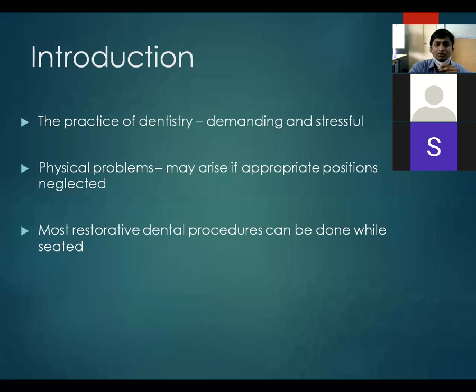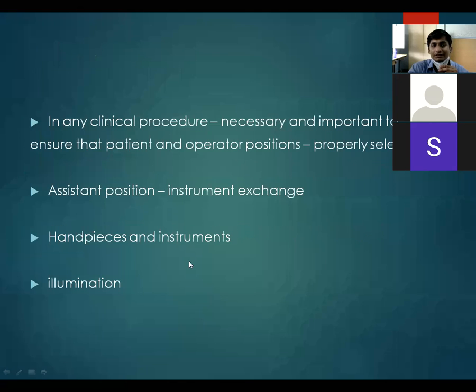Most restorative dental procedures can be done while seated. Compared to the other departments, most of the procedures done in the restorative department or endodontics department are done while you are sitting. So most of the restorative dental procedures can be done while seated.